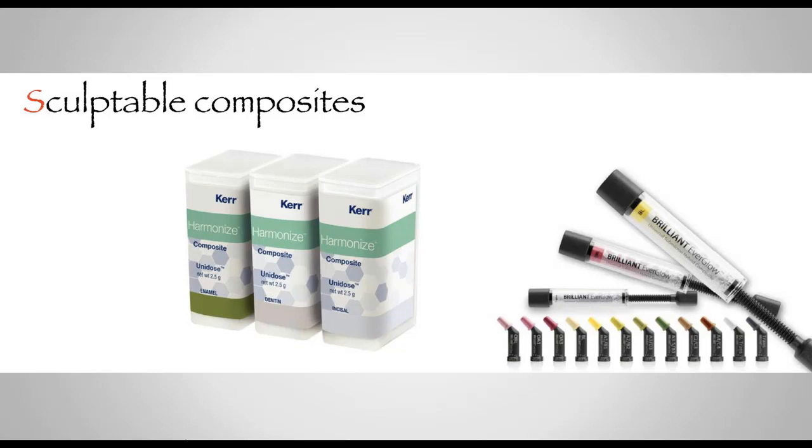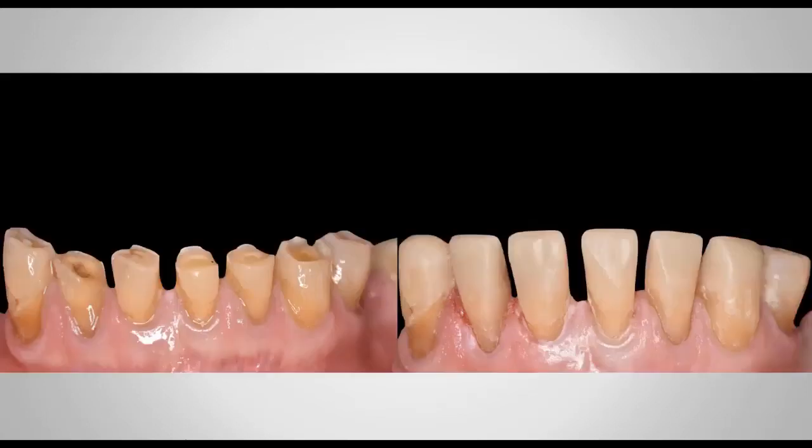I'm going to show you a case using sculptable composites. I'm not going to show you the whole technique because again, I use more flowable composites than sculptable composites for this technique, but this is an option, and I'll show you a case so that you can evaluate it and see if this is something that may fit your practice. But this is one really good option.